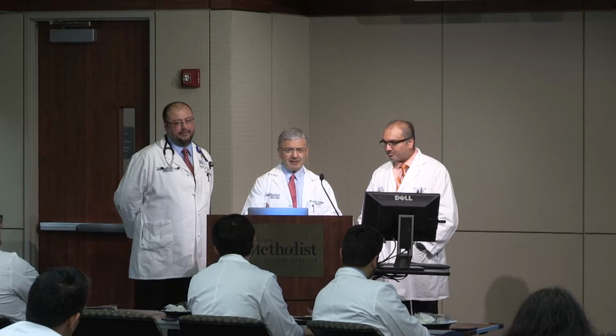And remember, for the clinically meaningful one, you have to marry this with coronary anatomy and physiology too. So yes, ventricular function, scar, whatever uptake, have prognostic data, but from a management of patients with ischemic heart disease standpoint, I think you're going to have to marry those.